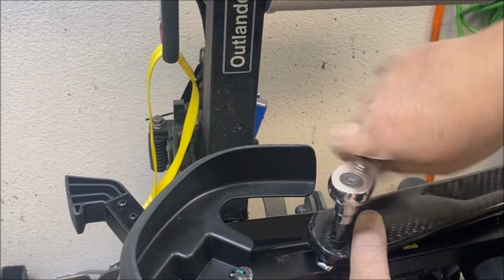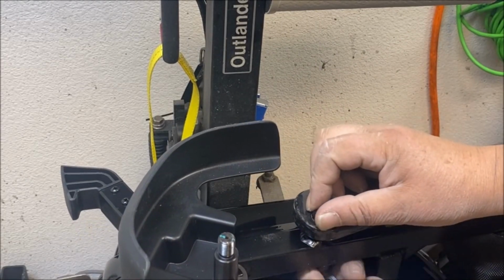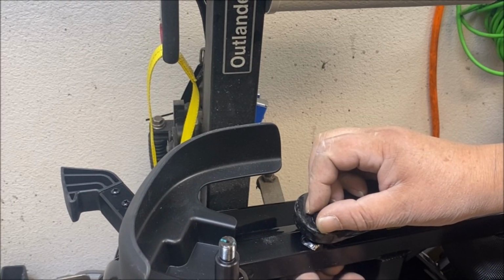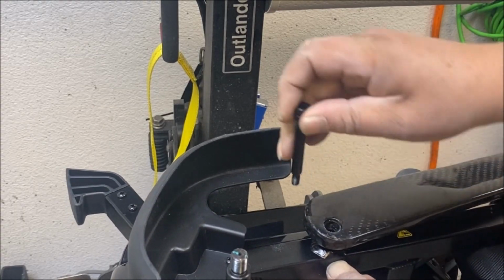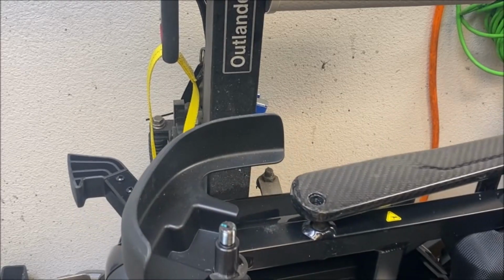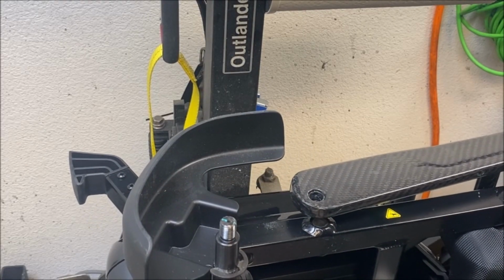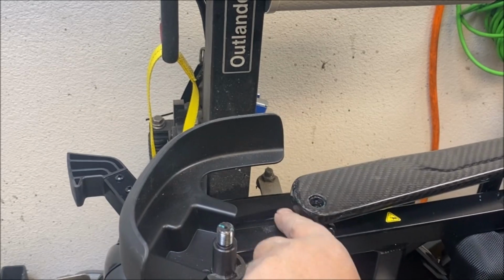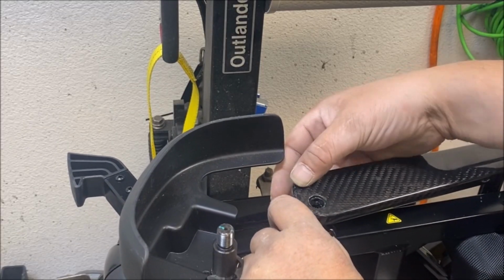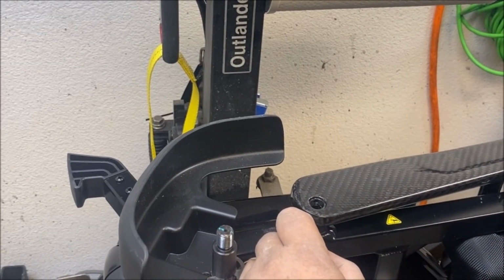Mil wrench, 4 mil Allen, spacer in the middle. It looks like it goes through the frame there. Yeah, there's like little spacers in there, pivot joint.